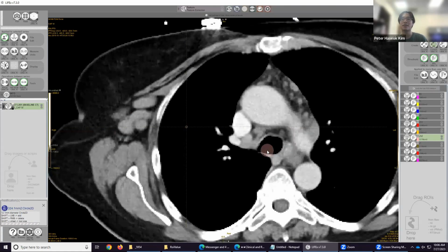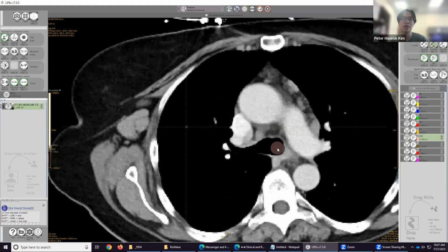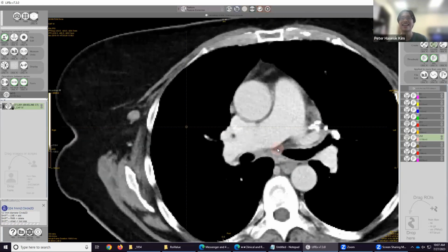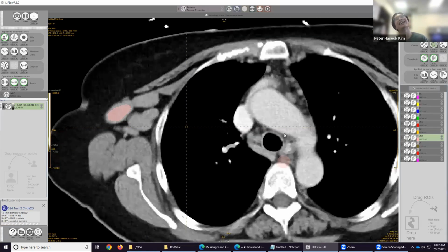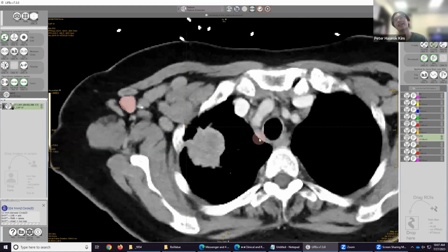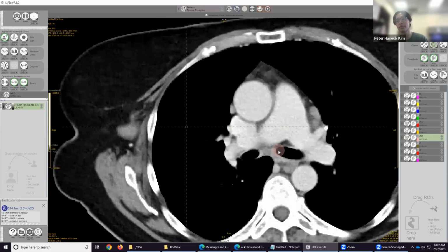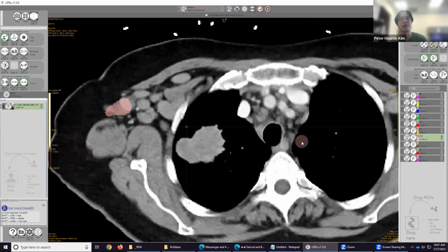If there is difficulty in finding lesions that are surrounded by soft tissue, or, like you said, lymph nodes that are pretty small, I would hope that there is a medical professional there to discern what is and isn't the lesion. And if it is too unclear, then I think the right thing to do would be to exclude that patient from the study, because it's very unclear.